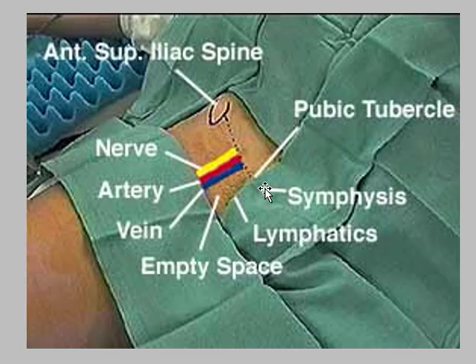In the cath lab, the femoral approach, you all know your femoral anatomy, and the acronym is NAVEL. Nerve, artery, vein, empty space, and lymphatic. It's a useful way of remembering. The cardiologist palpates the artery and knows the vein lies medial to it.